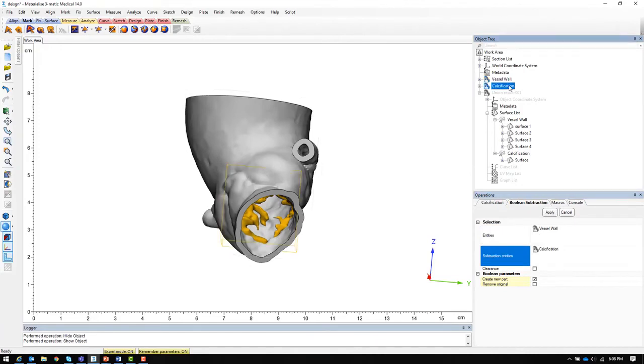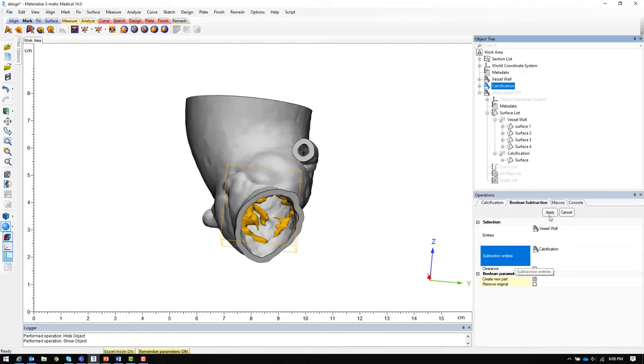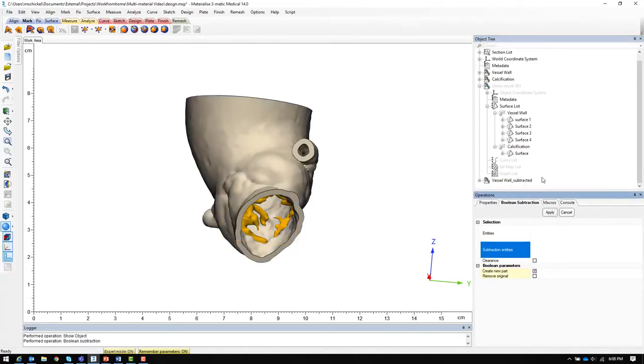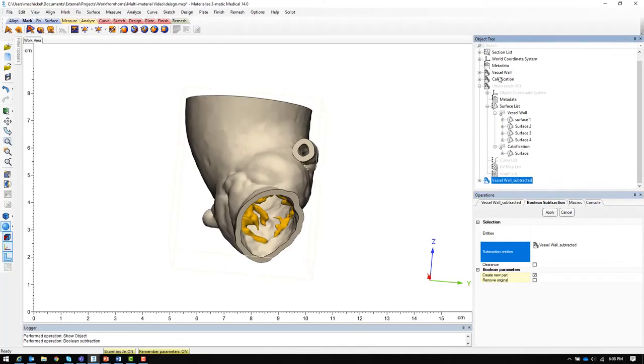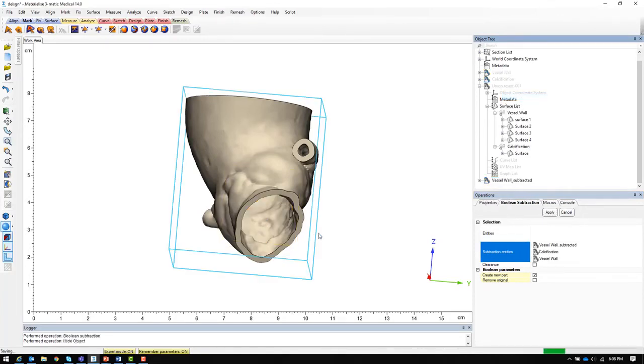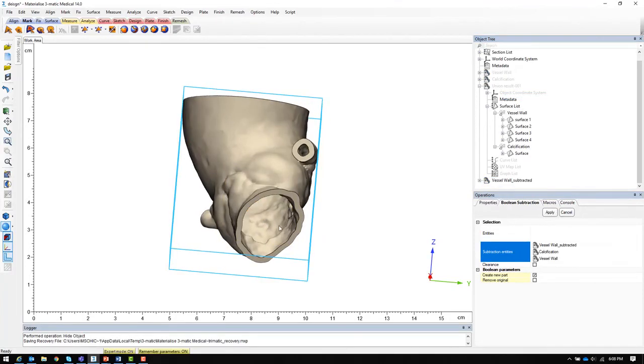In this case the vessel wall will be the entity. The calcification will be the subtraction entity. We click apply and we will end up with a new vessel wall model which does not have the area where the calcifications are located.